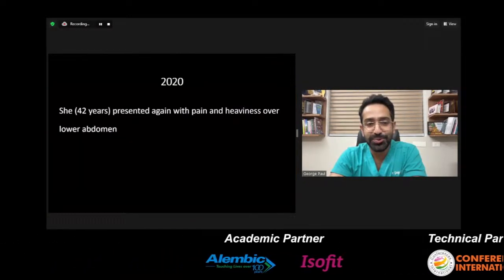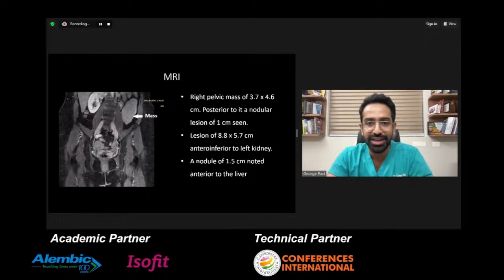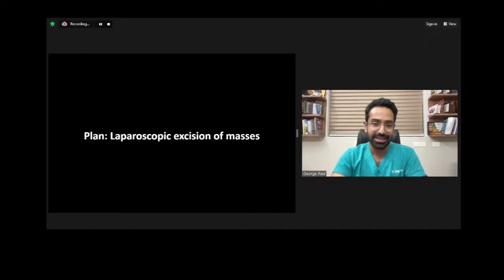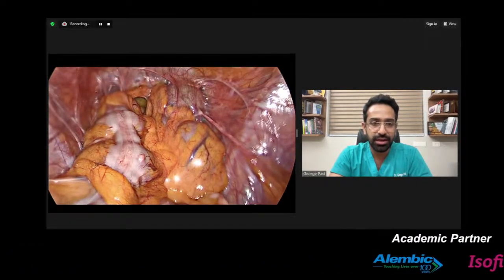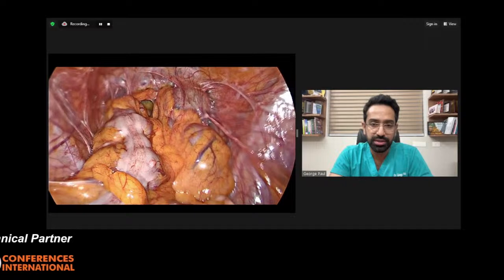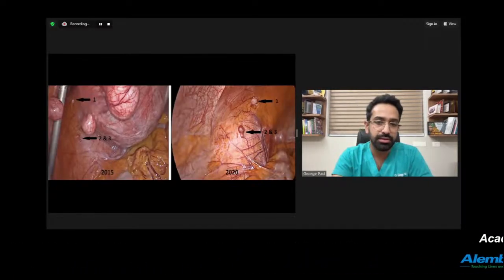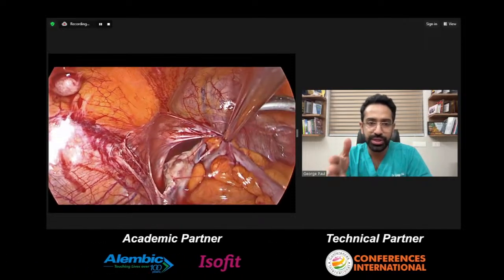Then later in 2020, she was 42 years old. She came with a vague abdominal pain, and MRI showed multiple masses and one as large as 8 centimeters. So then we went in again, and this is the current picture. Again, you can see the small studded myomas along the abdominal wall. This is comparing 2015 and 2020.